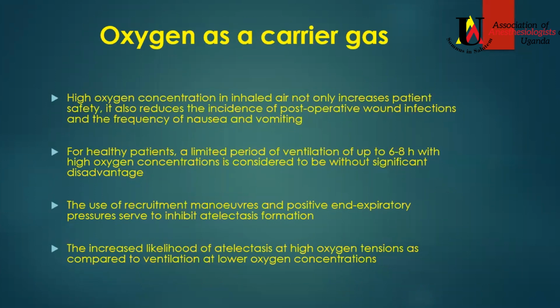So high oxygen concentration has a lot of advantages. We all know we like oxygen, but it increases patient safety. It also reduces the incidence of postoperative wound infection and the frequency of nausea and vomiting, although some still debate the nausea and vomiting. So for most healthy patients, a limited period of ventilation of up to 6 to 8 hours with high oxygen concentration has been shown to have no significant disadvantage.